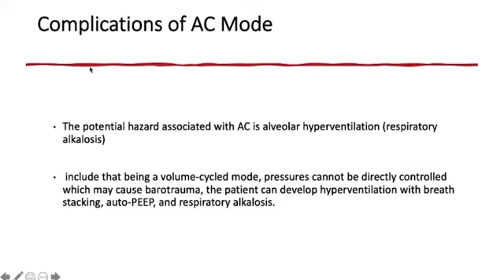Complications for AC mode. The potential hazard complications associated with AC are alveolar hyperventilation and respiratory alkalosis.